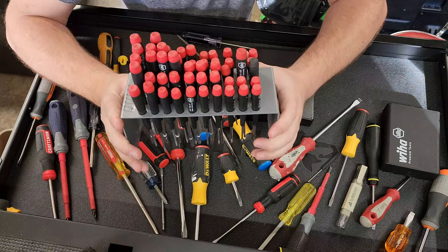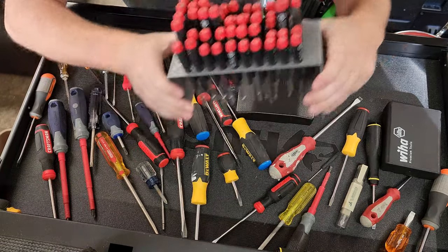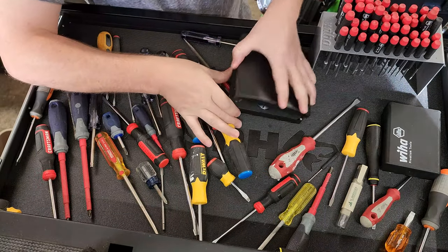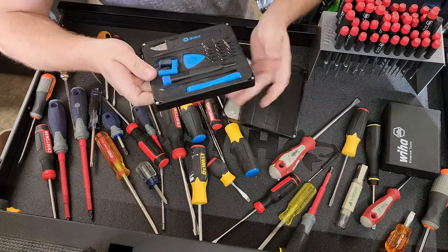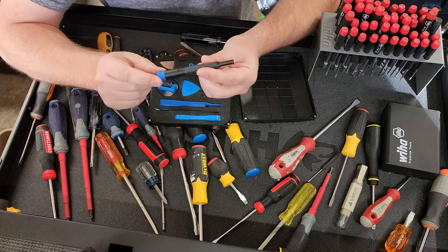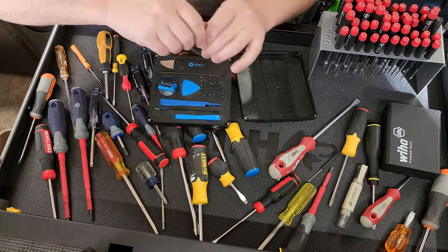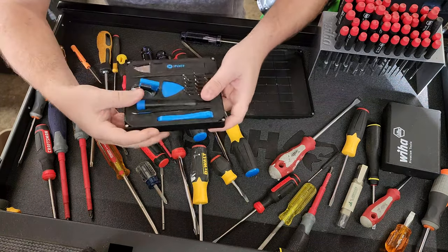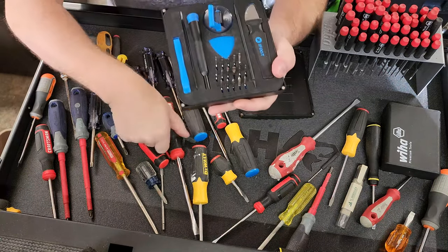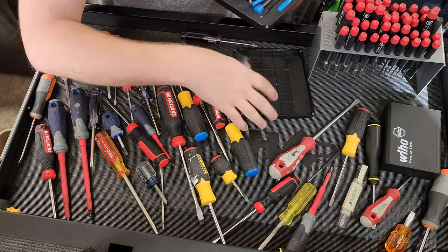The next set of screwdrivers you should know are called precision drivers. This is a precision driver kit, and I have some other precision drivers as well. One of the attributes of a precision driver is that it's for light duty. They usually have a spinny cap so you can put pressure while you're spinning it. These use a much, much smaller size bit — these bits are tiny compared to the size of a standard driver. So those are precision drivers, and usually they come in a kit of some sort.